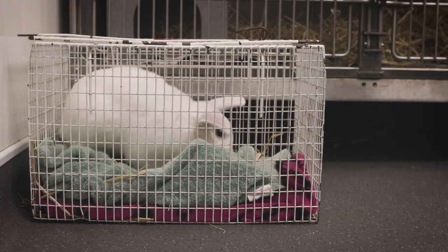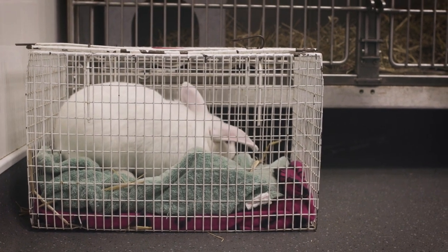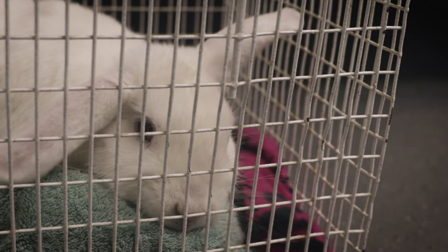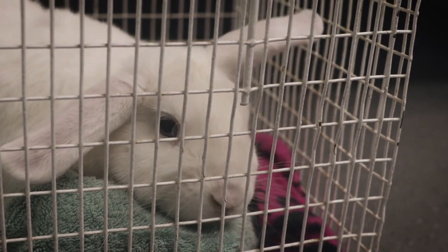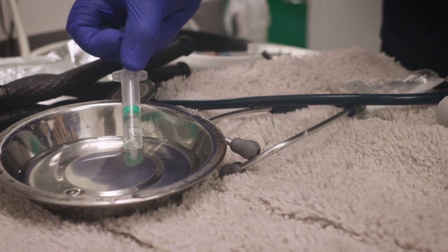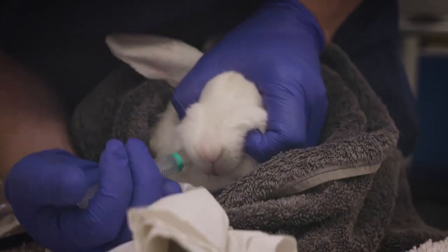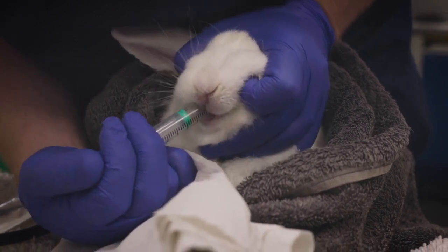Whilst rabbits are not fasted before anaesthesia, food can be removed 20 minutes prior to surgery. This can be beneficial in ensuring no food is held in the mouth or pharynx before any anaesthetic drugs are administered. To help remove any oral and pharyngeal food particles, a gentle mouth flush with 5 to 10 millilitres of water can also be carried out.